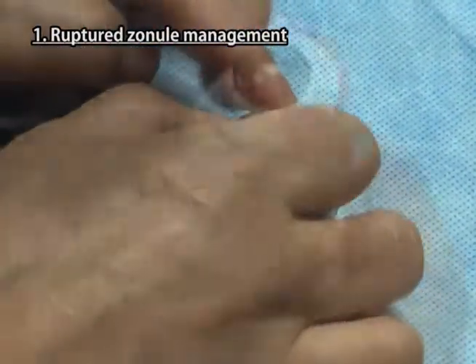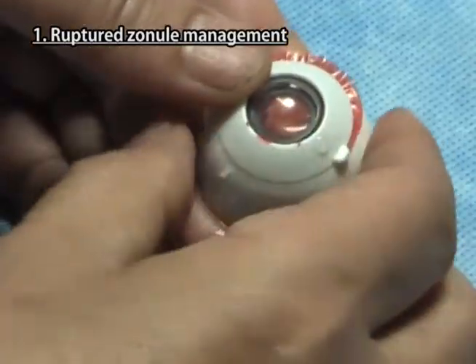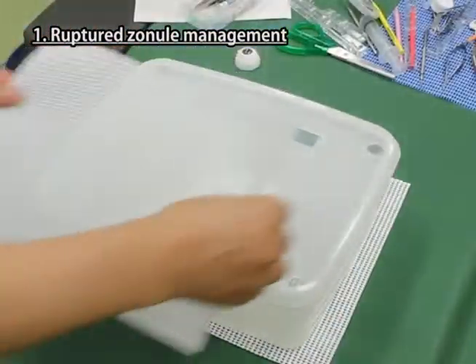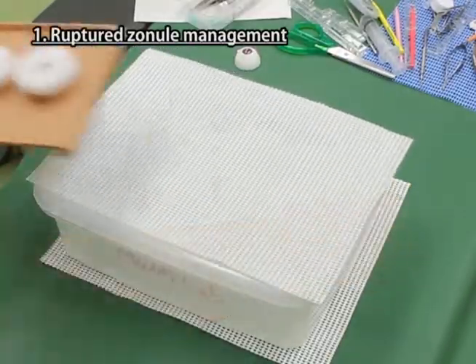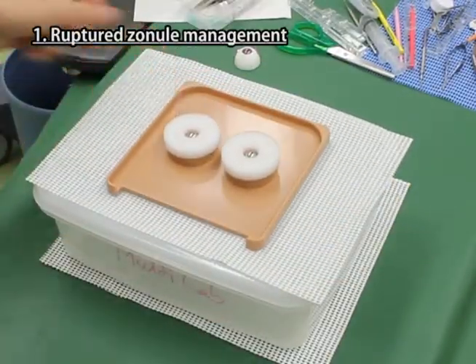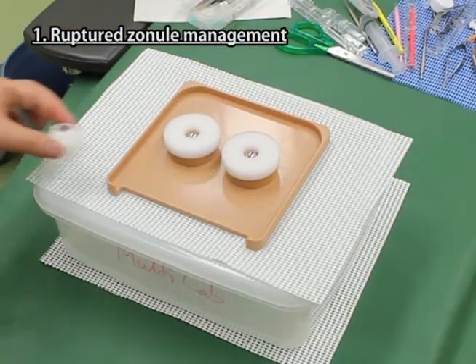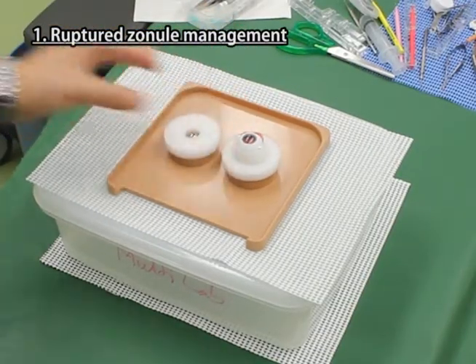Fix the cornea iris part firmly onto the sclera part. Lay the non-slip mats under and on the drainage box and place the base plate on it. Put the sponge on the iron ball of the right side, or the left side for a deep-set eye, and set the eyeball part on it.